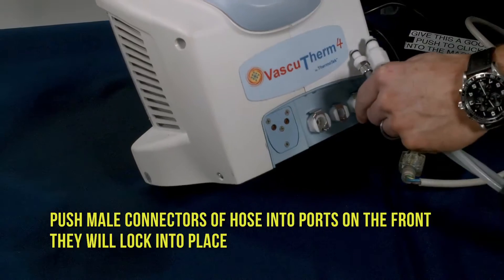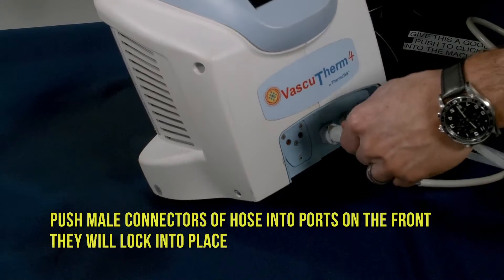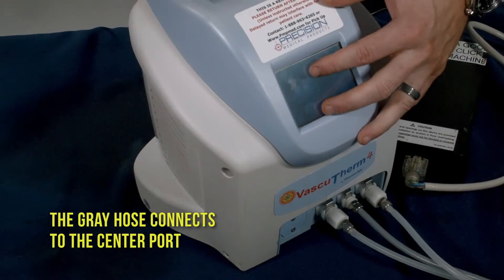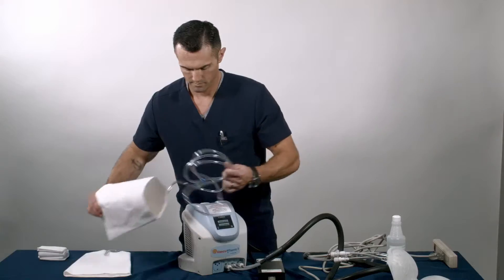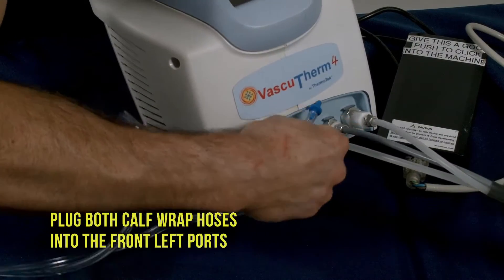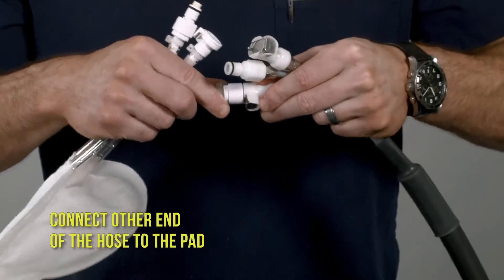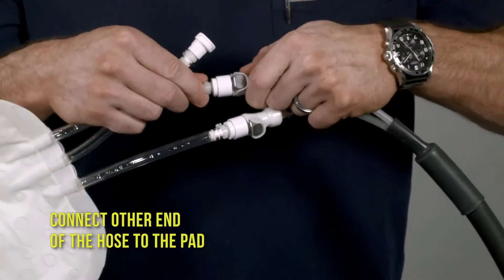Push the male connectors of the hose into the ports on the front — they will lock into place. The gray hose connects to the center port. Plug both calf wrap hoses into the front left ports. Connect the other end of the hose to the pad.